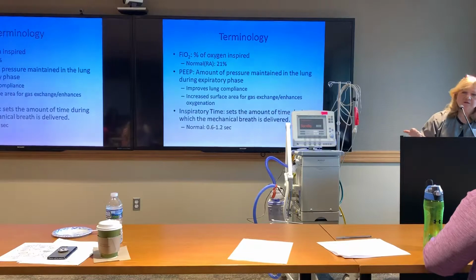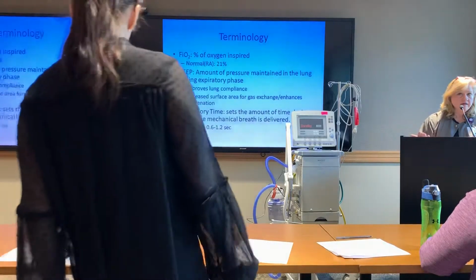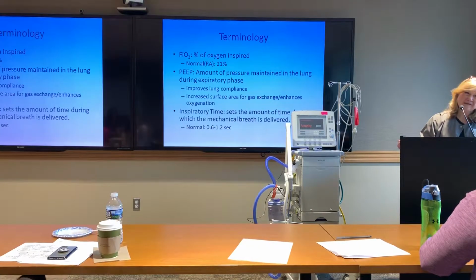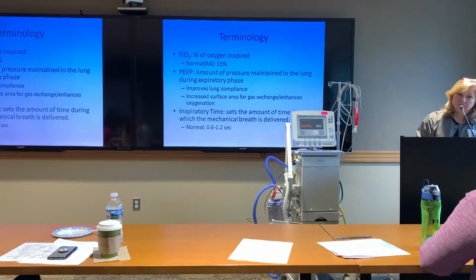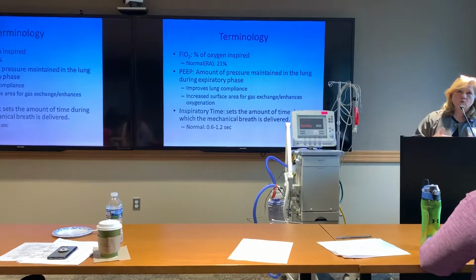So what it does do, though, is it opens up the lungs a little bit, helps increase alveolar size, gives them a larger surface area for gas exchange, improves lung compliance. What does that mean? Well, just like your heart might have a bad ventricle that loses its compliance, your lungs can either be really stiff, or they can be, in the case of COPD or emphysema, overly stretchy, right? So when you're really stiff, we add a little bit of PEEP to open it up and improve lung compliance. If your lung is stiff, it's very hard when you breathe. You're not going to move as much tidal volume with each breath. So we add a little bit of PEEP, and that might make it easy enough for you to start breathing.